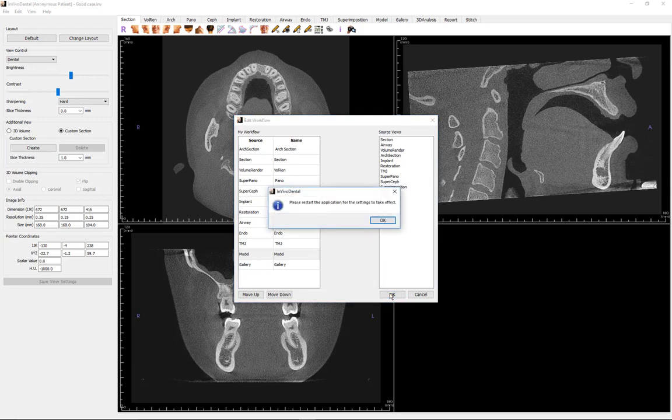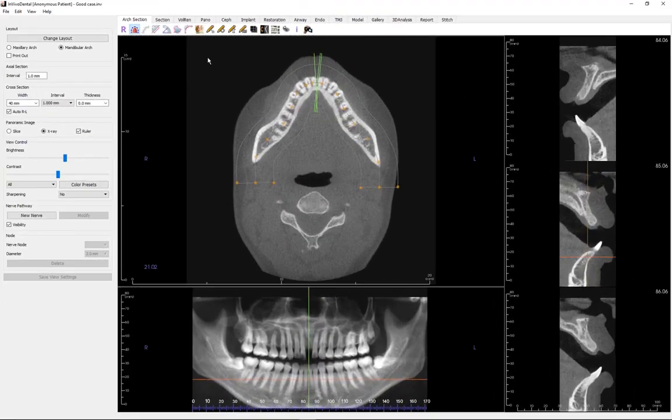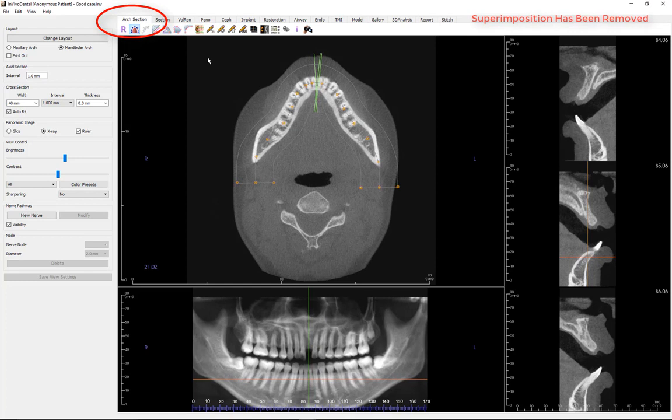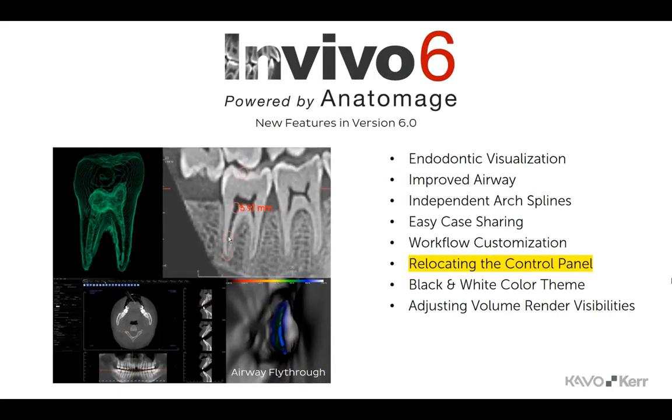Hereafter, when a scan is loaded into the software, the changes will be recognized. You will see that the Arch View tab has been renamed to the Arch section and is now open. The Superimposition tab has been removed from the list.